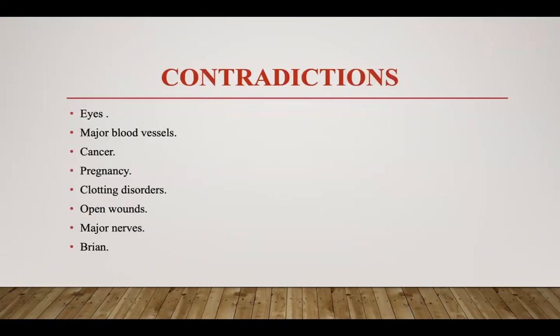Now let's move to the contraindications. Contraindications are basically the body parts that should not be affected by shockwave therapy, listed below. You can see it: eyes, major blood vessels, cancer, pregnancy, clotting disorders, open wounds, major nerves, brain.